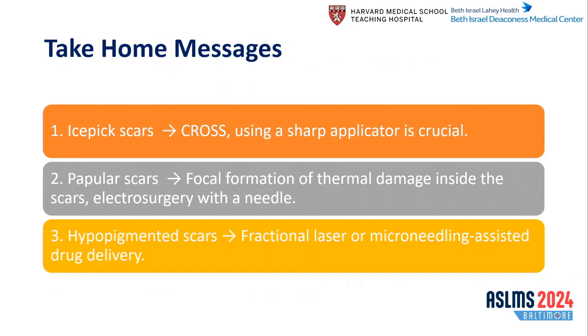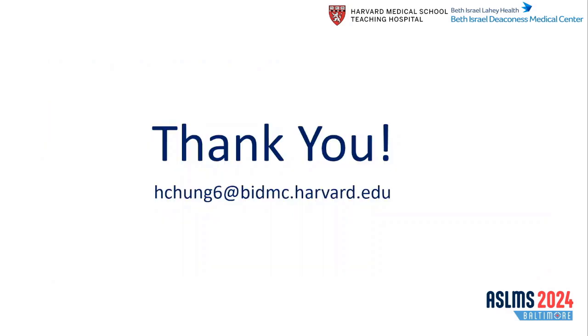So take-home message for ice-pick scars, please consider using the cross technique. However, using a sharpened applicator, a very, very sharp one, is key. And for papular scars, we want to create very focal thermal damage, and you can use electrosurgery with a needle. And for hypopigmented scars, fractional laser or microneedling-assisted prostaglandin F2 alpha analog delivery could be a good option. Thank you. Thank you very much.